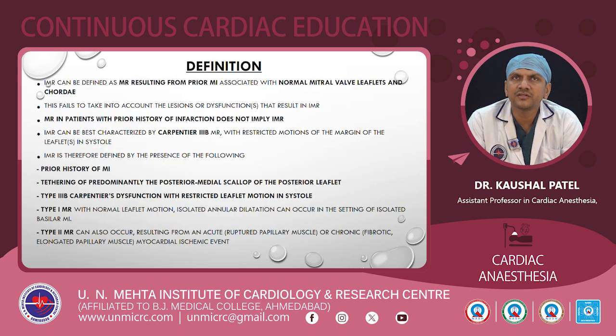Now coming to the definition of ischemic mitral regurgitation. Ischemic mitral regurgitation can be defined as MR resulting from a prior MI associated with a normal mitral valve leaflet and chordae. This is a very vague definition. It fails to take into account the lesion or dysfunction that results in ischemic mitral regurgitation. MR in a patient with a prior history of infarction does not imply ischemic mitral regurgitation.